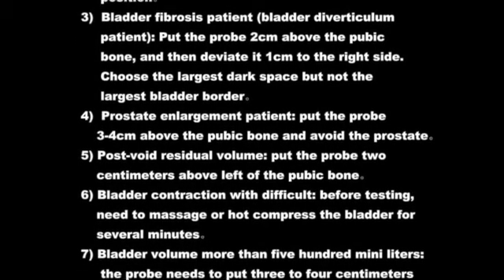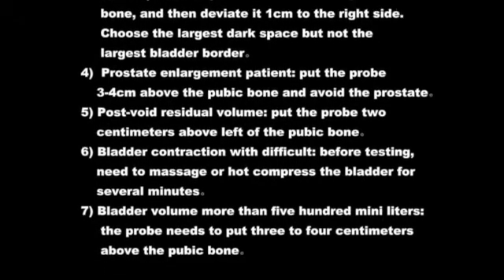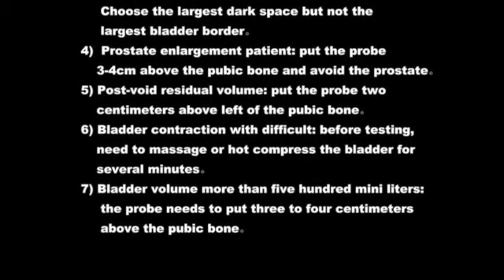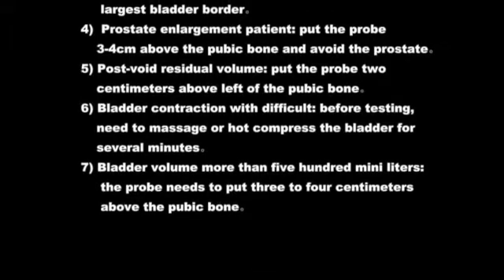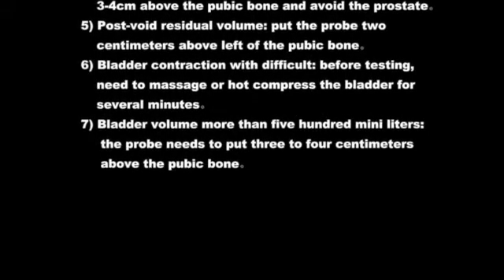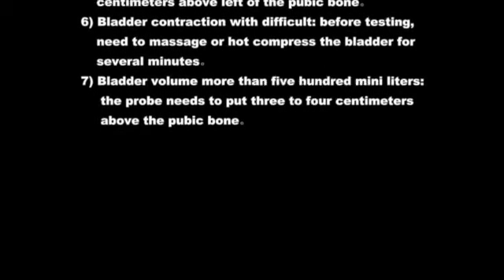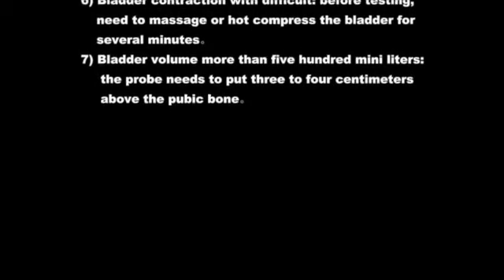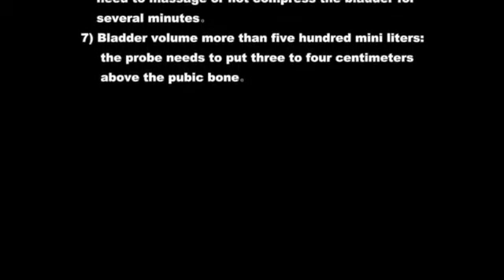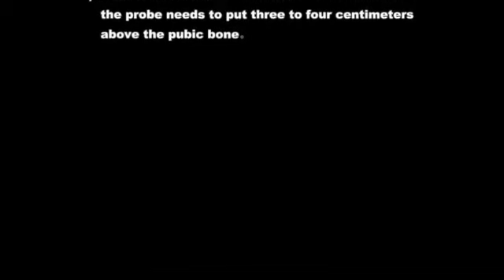Prostate enlargement patient, put the probe 3 to 4 centimetres above the pubic bone and avoid the prostate. Post-void residual volume, put the probe 2 centimetres above the left of the pubic bone. Bladder contraction with difficulty before testing, you need to massage or hot compress the bladder for several minutes. And bladder volume more than 500 millilitres, the probe needs to be put 3 to 4 centimetres above the pubic bone.